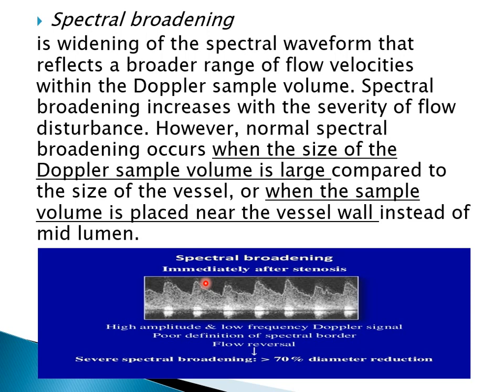Usually it's color. We put the color red and blue. Sometimes we need to use the power Doppler if the flow is slow and we need to be sure there is a flow.